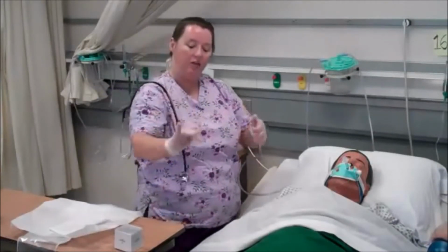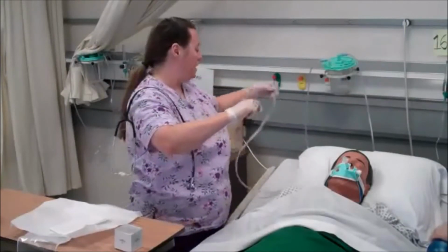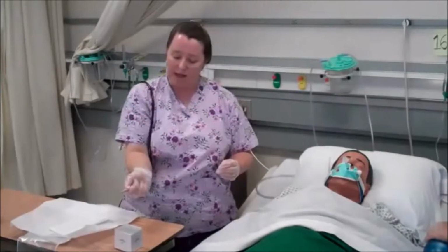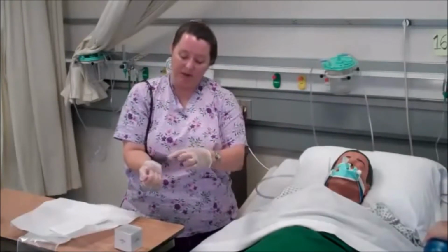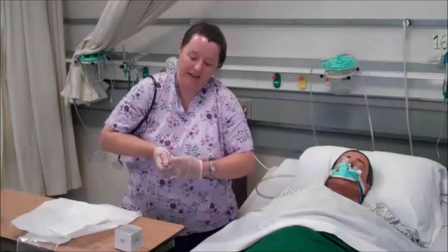I'm going to take and gather that catheter in my hand. I'm going to remove my vacuum source. You can go ahead and turn that off for me. And now I'm going to remove my gloves. My tubing is in my dominant hand. I'm going to touch dirty to dirty, so I'm not touching my skin.